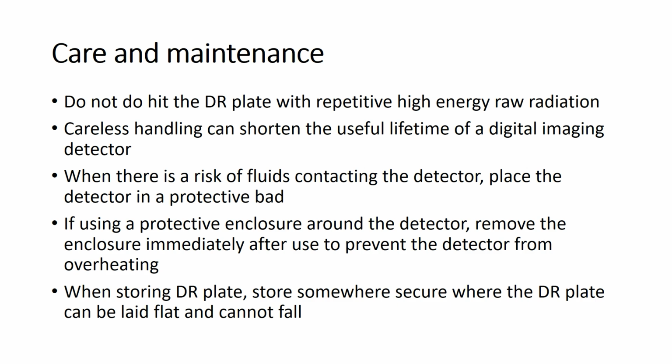When there is a risk of fluid contacting the detector, place the detector in a protective bag. If you are using a protective enclosure around the detector, remove the enclosure immediately after use to prevent the detector from overheating.